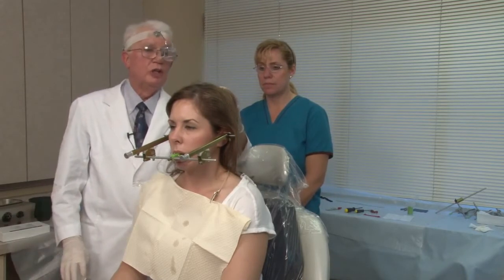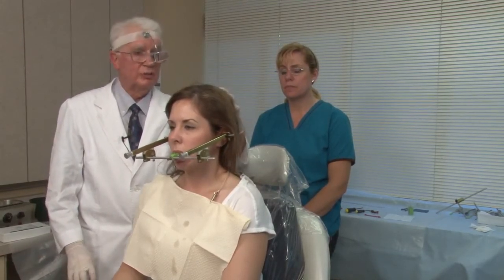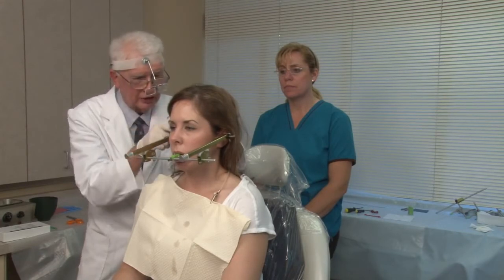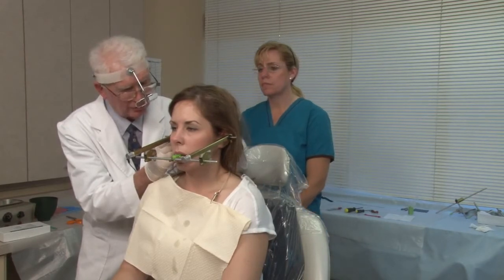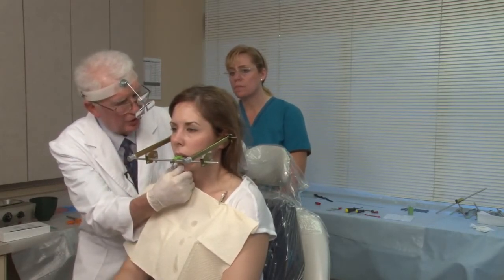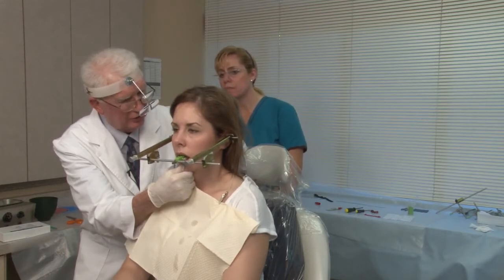And I do it only with fingertip support, not your whole palm, because you'll move the hair and stretch the skin. So you do just fingertip touch here, and then I'll come to this point, and I have to reestablish and make sure my patient is on the hinge axis. So I'm going to control the mandible, but at the same time, I'm going to loosen the stylus pen, move it in close to the skin, not going to touch the skin, and I'm going to have the patient open and close, open and close. So I'm kind of using the skin as my flag to make sure that she's stable.